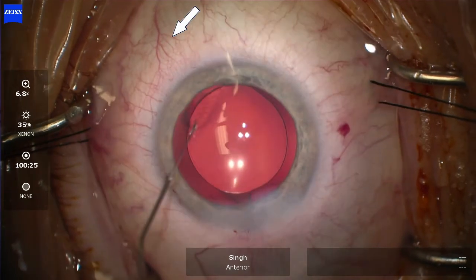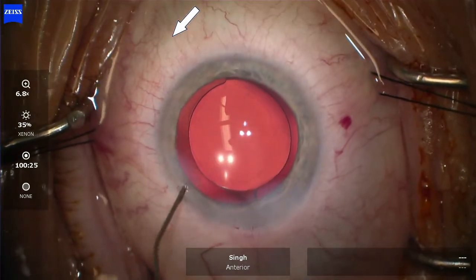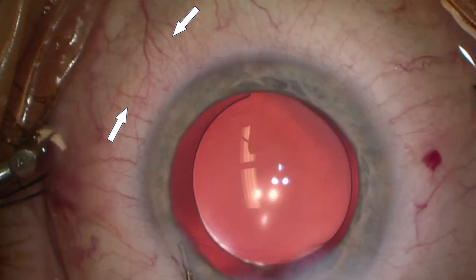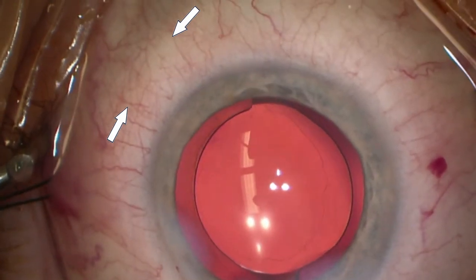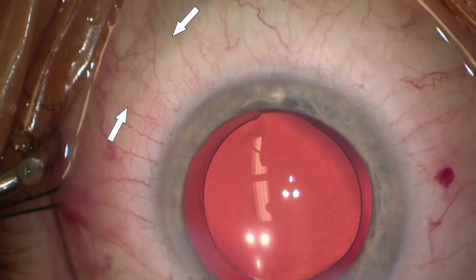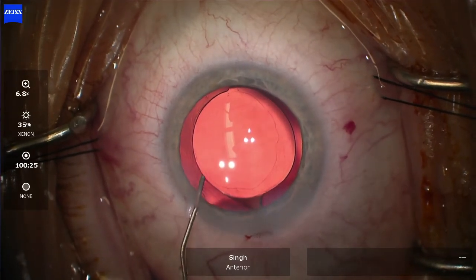Watch as I fill up the eye at the end of the case with BSS and hydrate my wounds. Look at that arrow — you can see the blanching. In slow motion, watch those arrows: you see about three clock hours of blanching as I inject BSS into the anterior chamber, which just completely whitens that area out. So with those small microgoniotomies, we truly can create a significant improvement in outflow, as shown here simply with manual BSS insertion into the anterior chamber. I really hope this helped you — thank you so much.